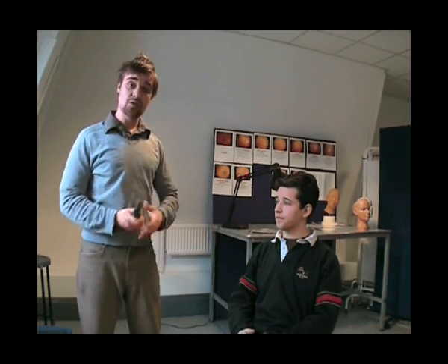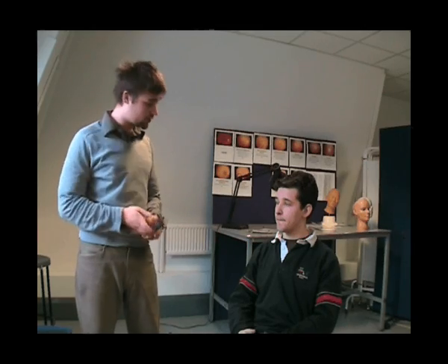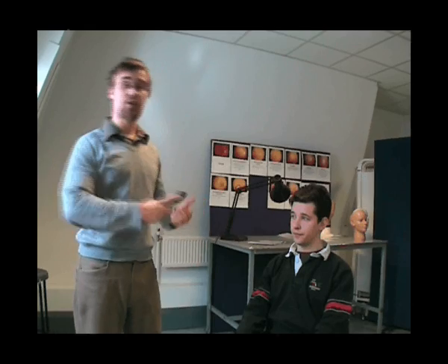Once you've done this eye, you thank the patient, and if you need to, you do the other eye. You would then go and document and report any abnormalities to a colleague. It's worth remembering that this procedure is actually done as a whole. I've demonstrated it in three parts here — looking at the optic disc, the quadrants, and the macula — but you want to do it as one movement rather than focusing three times on the retina.